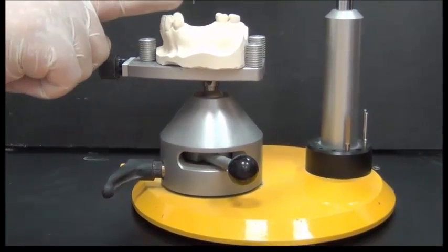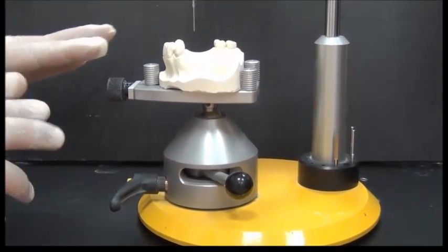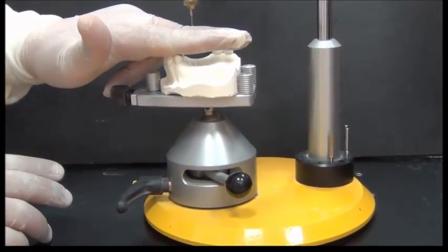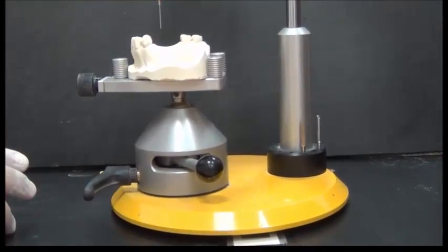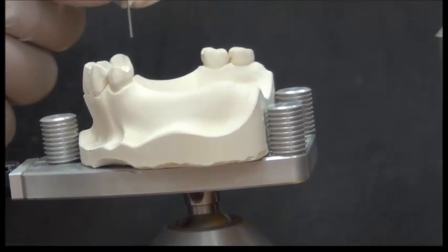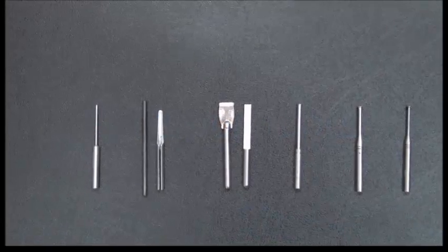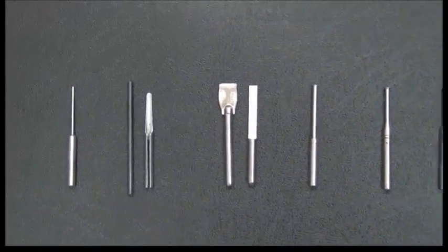Once we place the cast over the table, we also should make sure that the cast is trimmed in a way that the occlusal table is also parallel with the floor. Okay, so now let us take a closer look at the instruments we attach. And now we will take a closer look at the instruments we use with the surveyor.